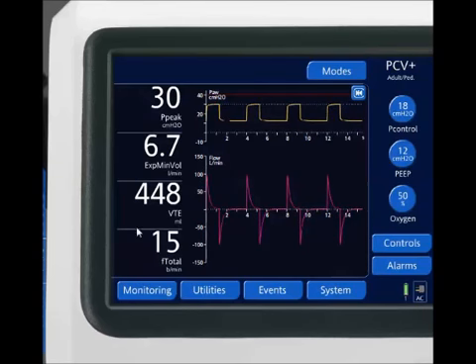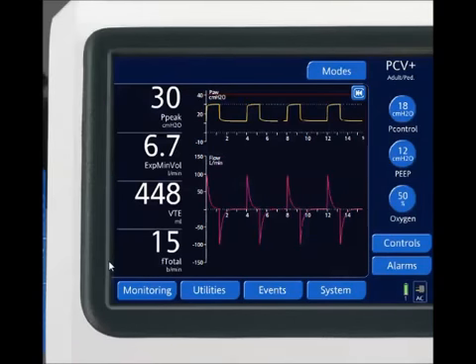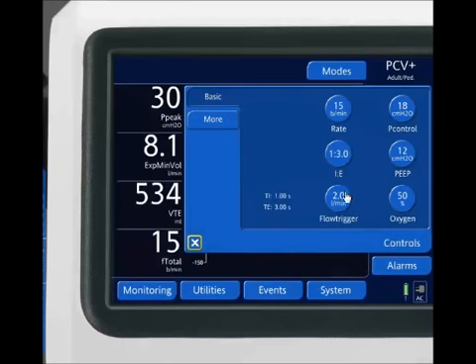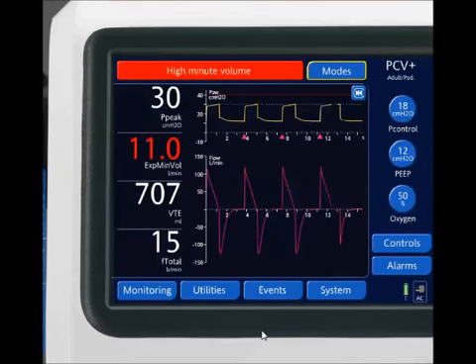As you notice, my tidal volume is the same. But it shouldn't be the same. That's why I'm surprised. Patient now has a very vigorous drive, and I should have a lot higher flow demand. Interesting. Let's see what my trigger is set at. There we go. So there is some lag with the simulator. There we go. That's what I wanted to show. So we have a huge, and the patient is going to have a higher minute ventilation demand. And I'm going to just silence that alarm real quick.